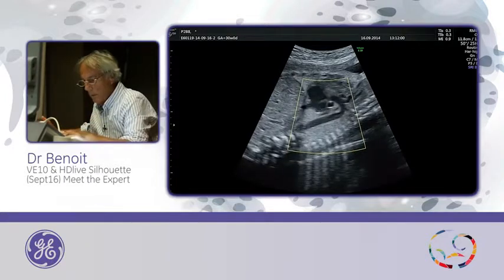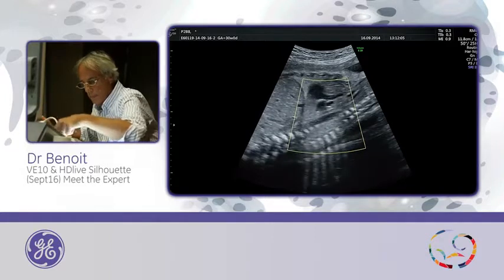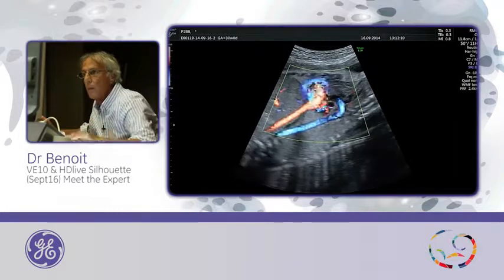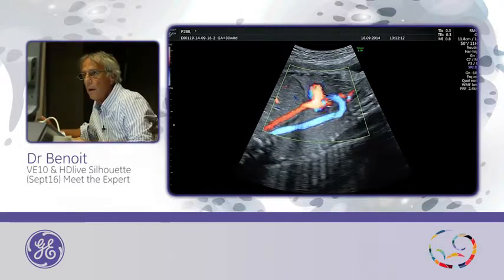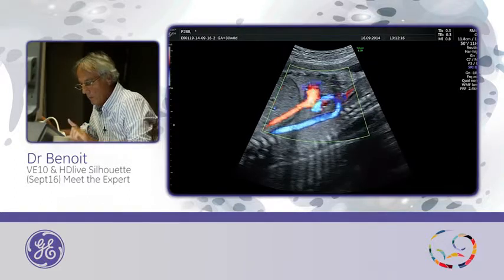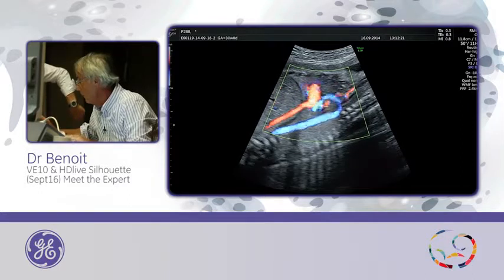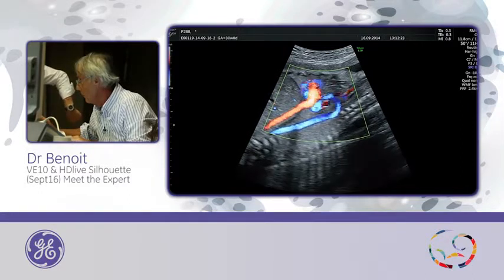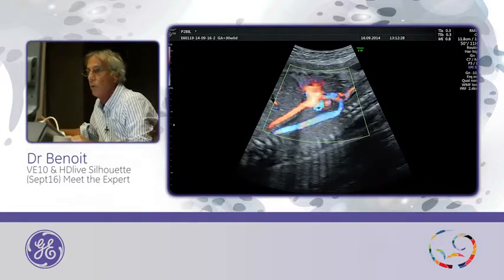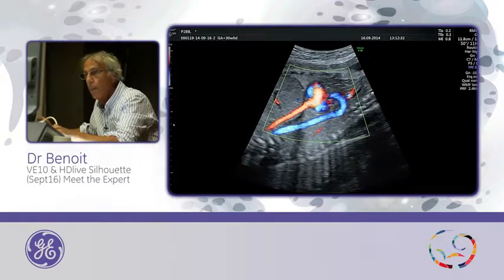So we will do a nice view of the aortic arch. Okay, I will do it with a STIC. I have 17 minutes. Until? It's now 1:15, so until 1:30. It finishes at 1:30. Okay, so I do this and then we'll open some cases.